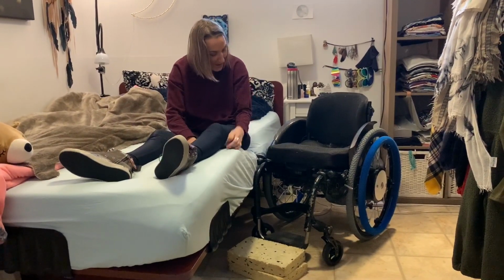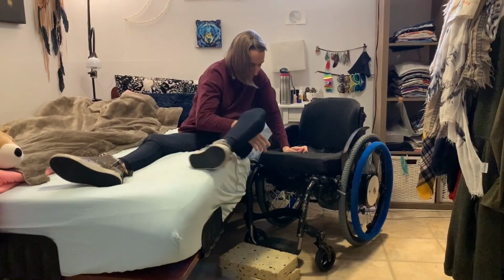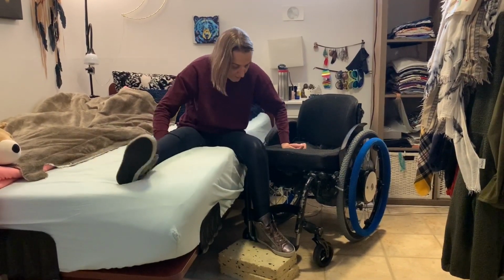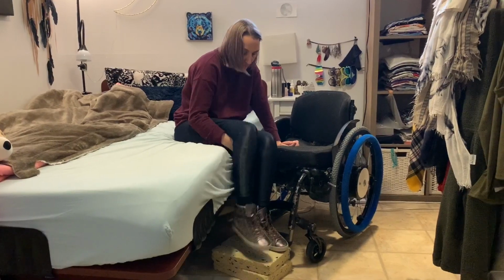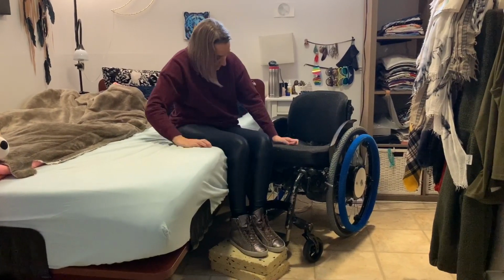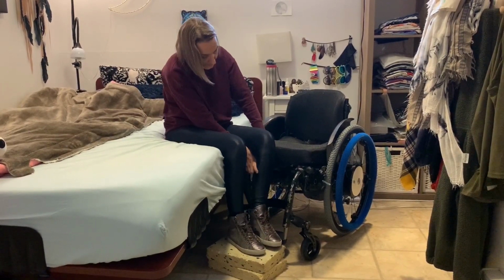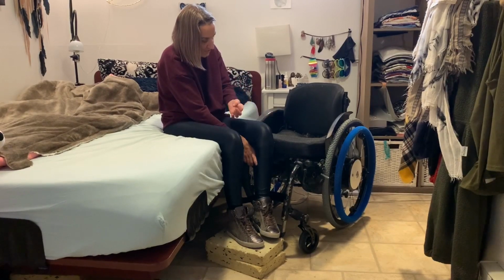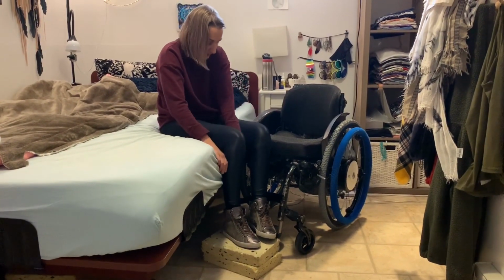Now transferring back. So again, it's just the reverse kind of thing, bringing my legs down. And making sure that I have one leg on the foot plate, in the direction that you're going to be sitting when you're on the chair. If you can, it makes it a bit easier.